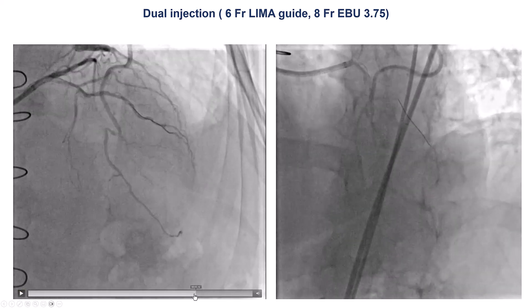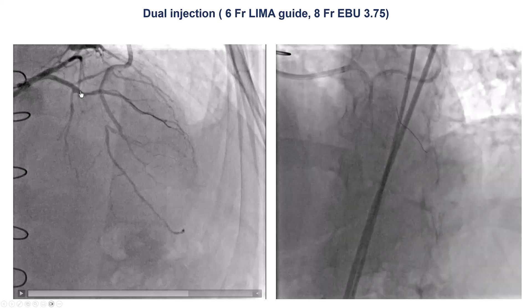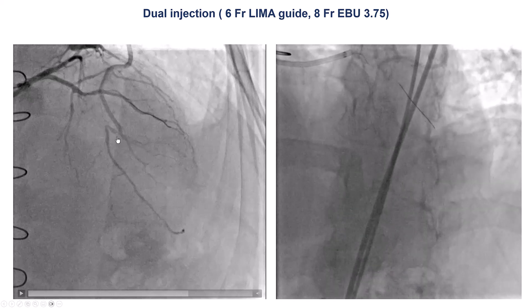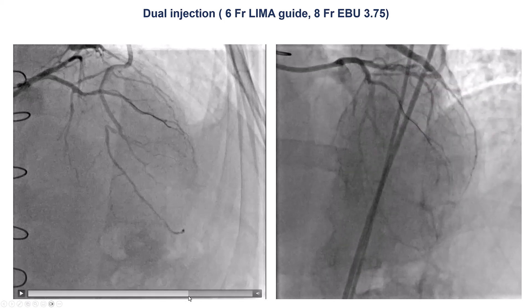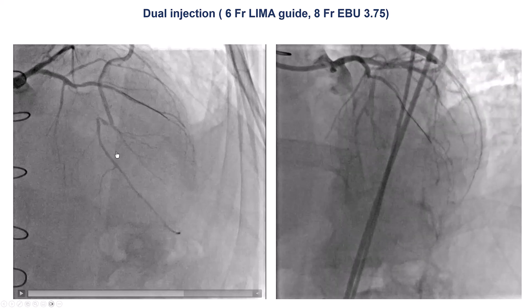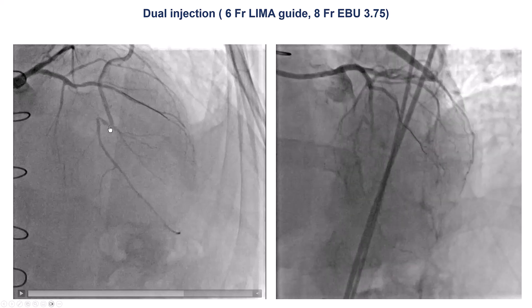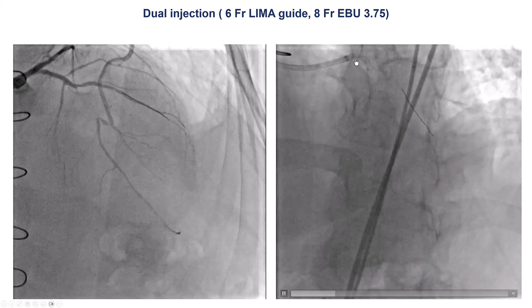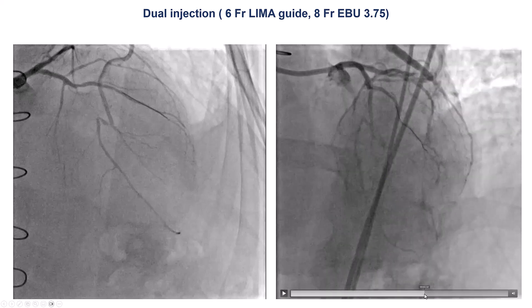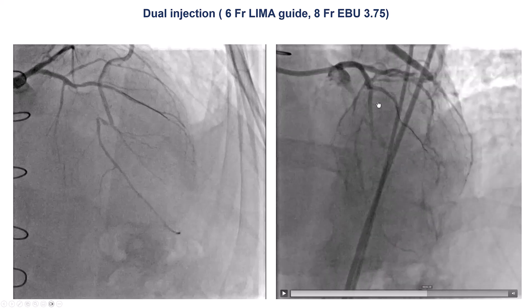There is a CTO right at the takeoff of the first or second diagonal. Then there is the occluded segment, and then there is another diagonal that has the LIMA. However, there is a tight lesion just proximal to the touchdown of the LIMA graft, so essentially the LAD territory is not getting perfused well because of the severe lesion proximal to the LIMA distal anastomosis. There is the LAD with the occlusion, and then reconstitution of the vessel distally through the LIMA graft.